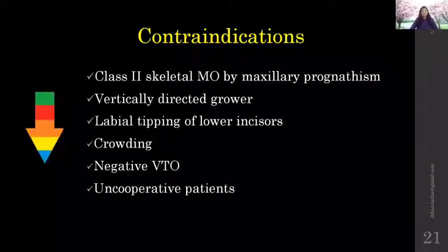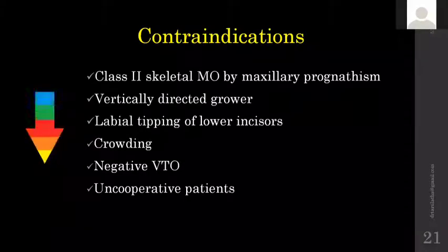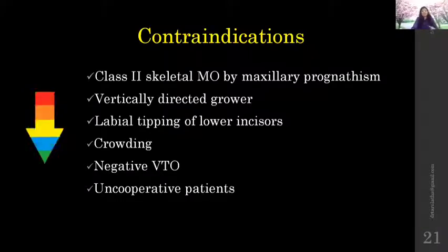Crowding, yes, I told you, you should not give. And in a negative VTO patient, you should not give. And also uncooperative patients, yes, you should not give in them because without cooperation, none of the appliances work, be it a fixed appliance or a removable appliance.